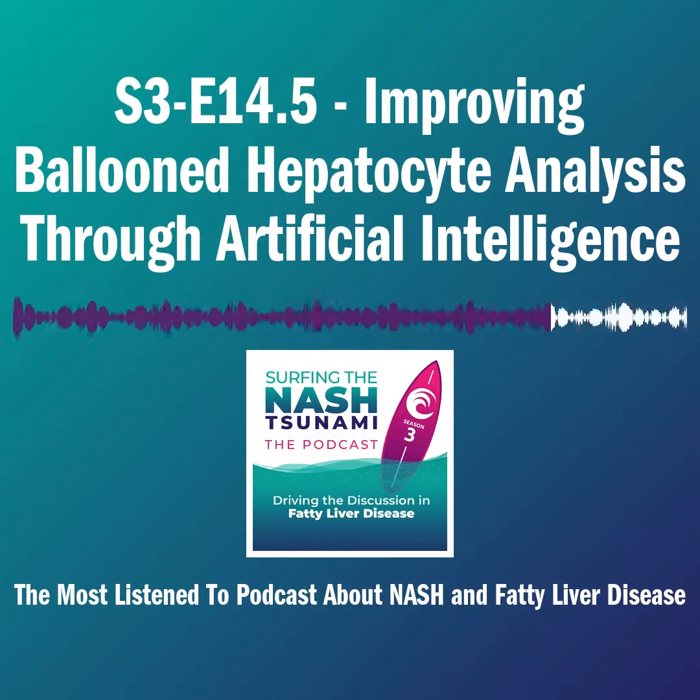outcomes are, of course, the best thing you can look at, but it's not easy to do outcome studies. So if you want to go for histology, I think you really need more details in terms of fibrosis changes and their relation to outcomes.